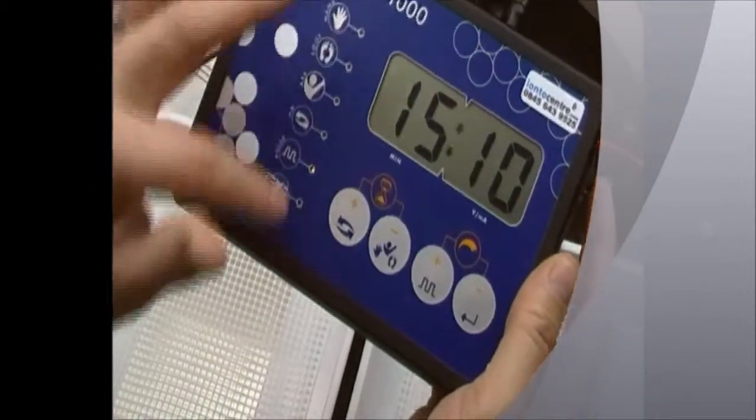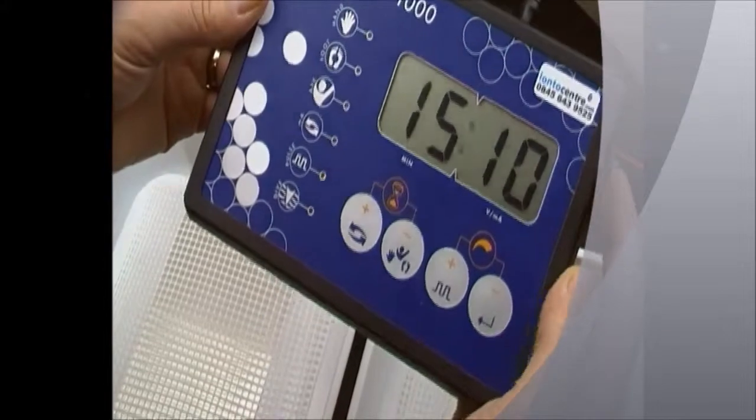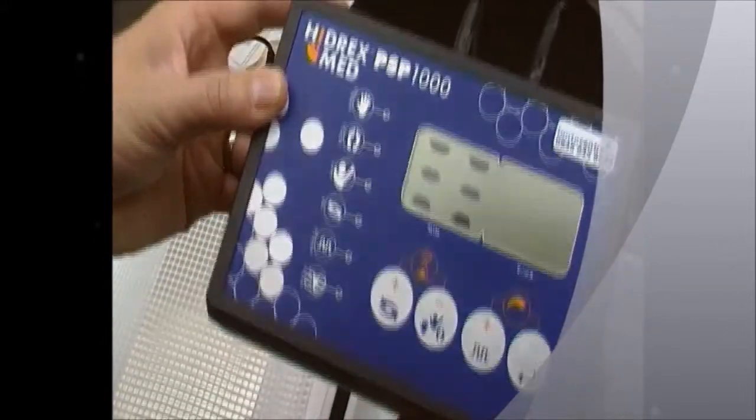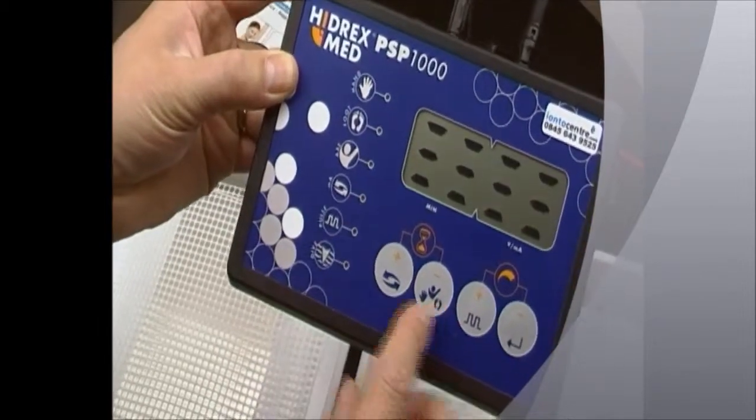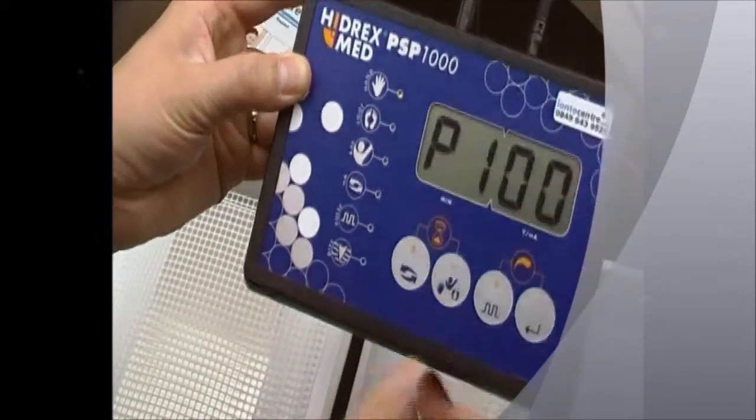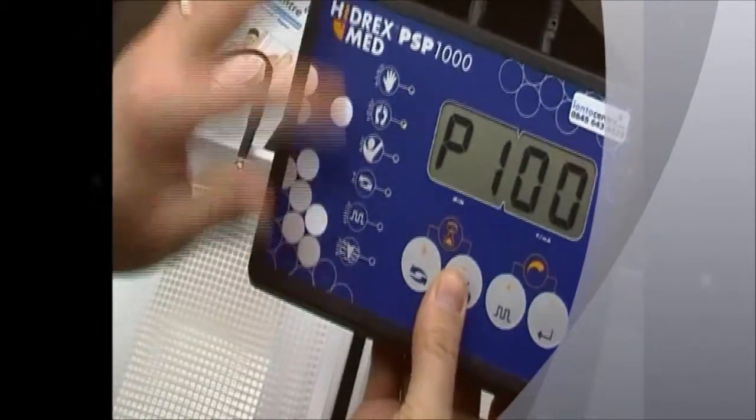You can only access the set menu just after turning the machine off and back on. The word 'set' will appear for a few seconds, and each of these buttons has an icon that corresponds to the setup mode you're in.